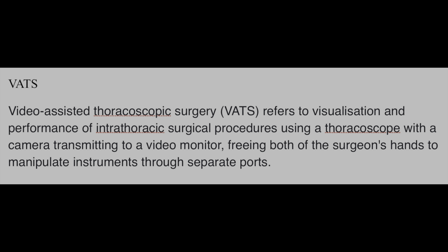Video assisted thoracoscopic surgery, VATS. VATS refers to visualization and performance of intrathoracic surgical procedures using a thoracoscope with a camera transmitting to a video monitor, freeing both hands of the surgeon to manipulate instruments through separate ports.